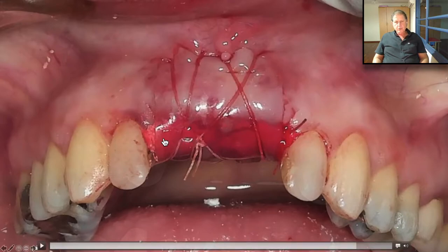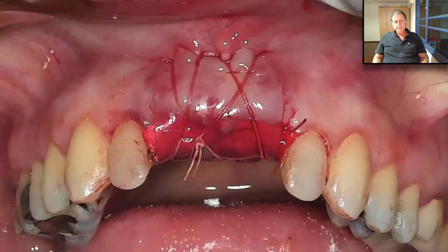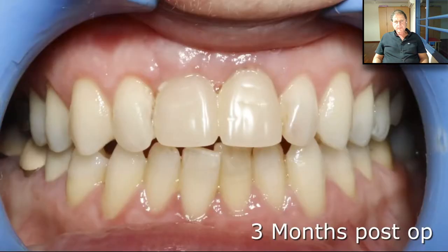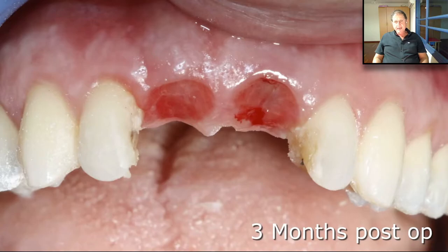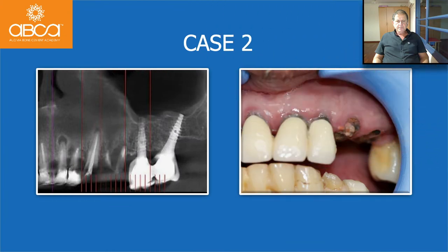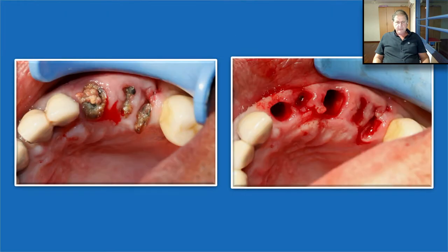Don't forget, everything here was open. Seven days post-op, that's how it looks. Three months post-op, you can see that the papilla is perfectly in place, and everything shows wonderful keratinized tissue. We can also do this when we need to reconstruct the ridge after many extractions — let's see how simple it is.